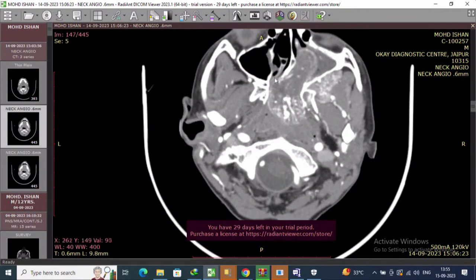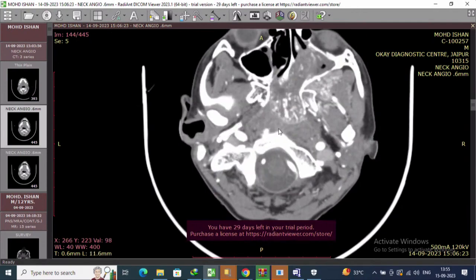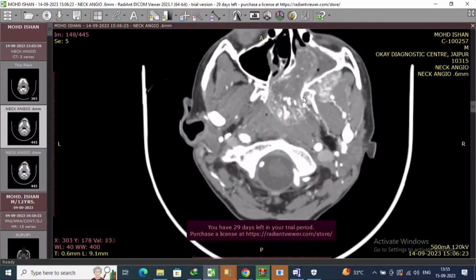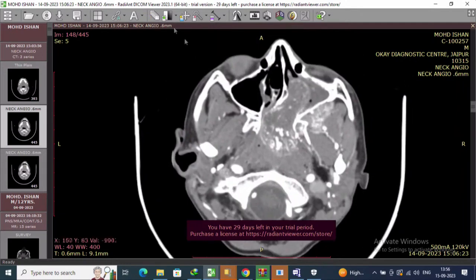Yes. Now, this is the component going in the nasopharynx. Can you see? Yes, sir. Lower down, nasopharynx. This is medial pterygoid plate. This is lateral pterygoid plate. This is lateral extension, which has a little bit of posterolateral component and then more anterolateral component. All clear? Now, this has a peculiar, unusual anterior extension. See this, which is rarely seen. Yes, sir. Clearly seen. And this makes the endoscopic surgeon's life difficult.